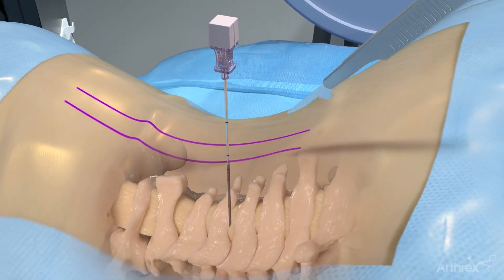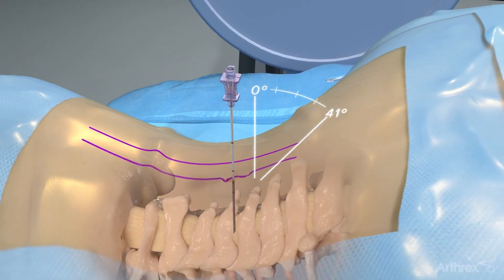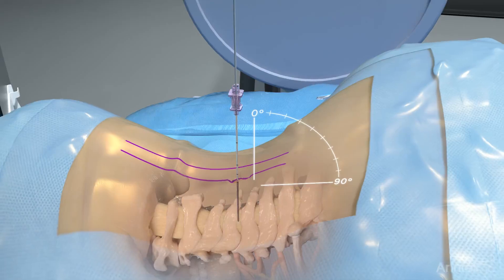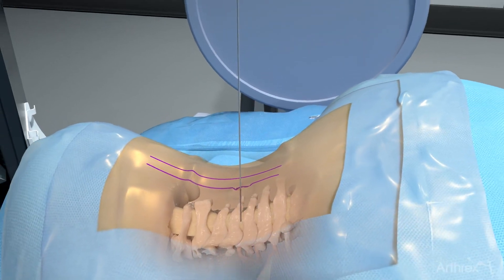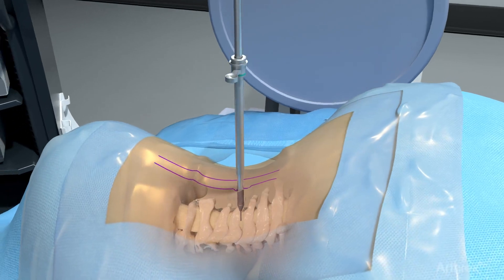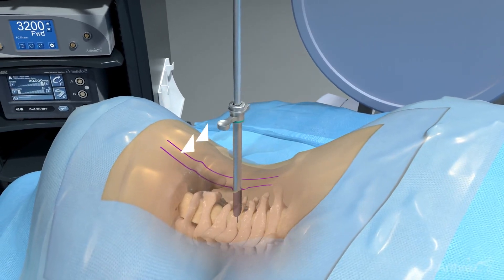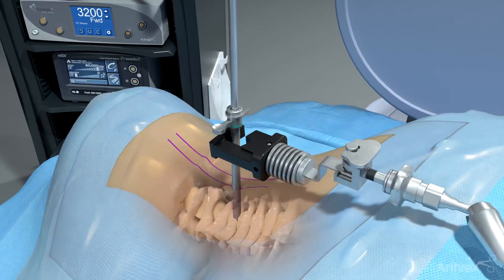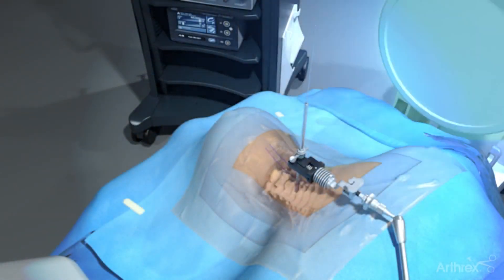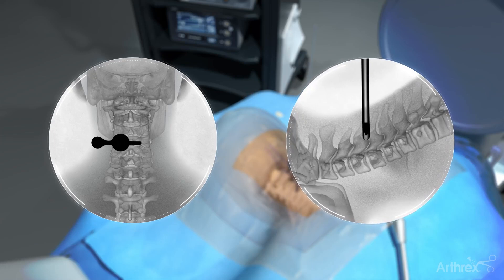Make a vertical skin incision, then insert the guide wire oriented 90 degrees to the floor, adjusting the bed as needed. Insert the switching stick and cannula. Free up tissue by medial to lateral movement of the cannula. Confirm cannula placement using lateral fluoroscopy and ensure its placement is 90 degrees to the spine.